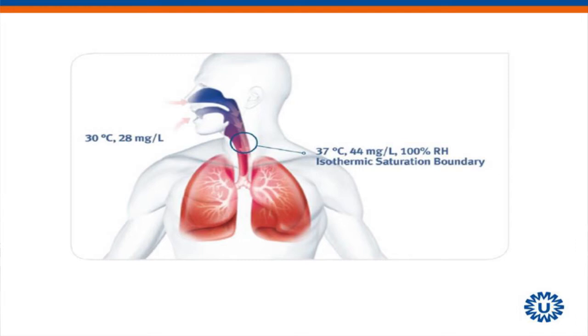But when you are ventilating your patient, you will see 37 in the pot, 40 before the air goes into the patient. Yes? What happens when we turn it to non-invasive? Which temperatures do we see then? Yeah, then we see 31 on the pot, I think. Yeah, 34. Okay, 34 on the pot and 34.